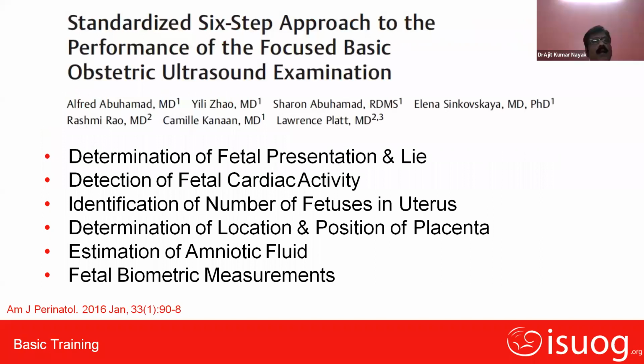So these are the parameters to be examined while doing a basic obstetric ultrasound, which is recommended by Dr. Abu Hamad, as we know, and we are going through his recommendations. So number one step is the determination of the fetal presentation and the lie of the fetus. The next step should be detection of the fetal cardiac activity. Step 3 is to identify whether it is a singleton pregnancy or a multifetal gestation.